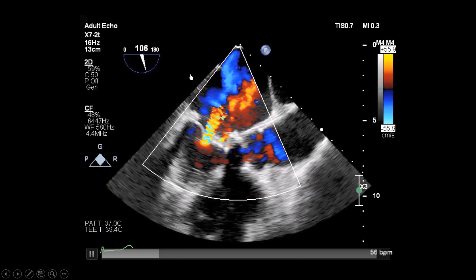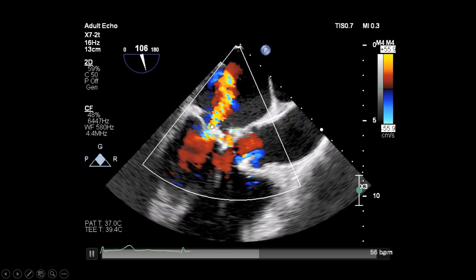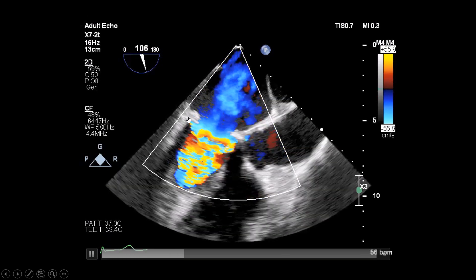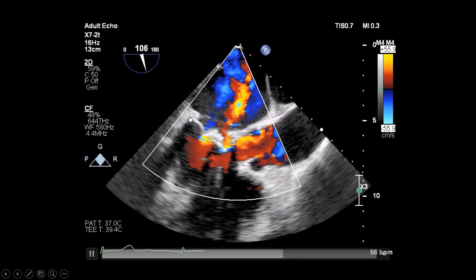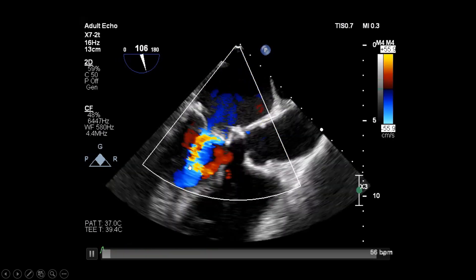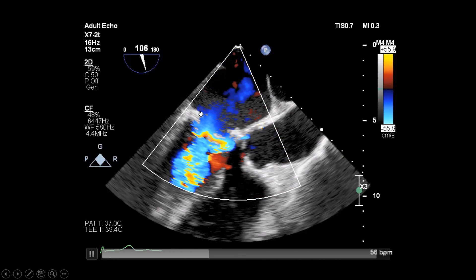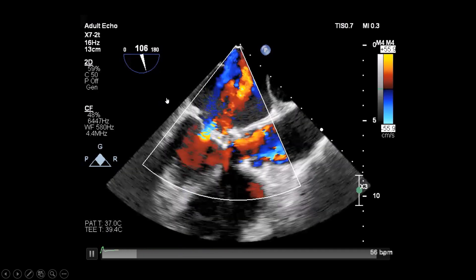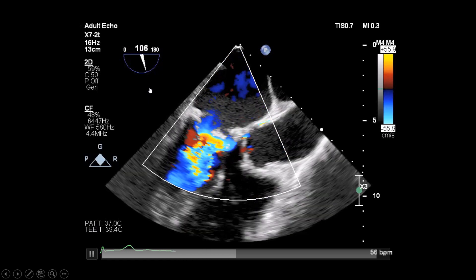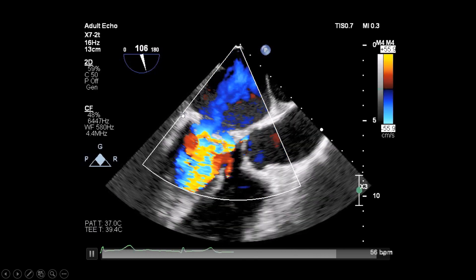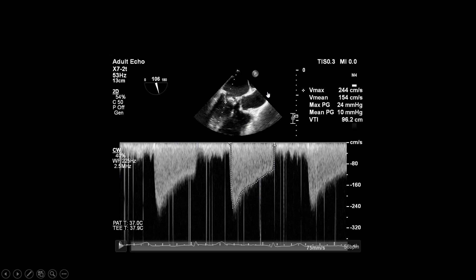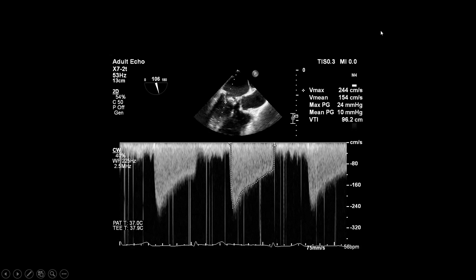You can also see a regurgitant jet back into the left atrium. This is the aortic valve. The shadow is because of the prosthetic ring of the mitral bioprosthesis, casting a shadow over the interventricular septum. This is a long axis view showing the aorta, ascending aorta, aortic valve, mitral bioprosthesis, and the posterior and anterior mitral annulus. The resting gradient under general anesthesia was 10 mmHg mean diastolic pressure gradient across the mitral bioprosthesis, which explains why the patient was truly symptomatic.